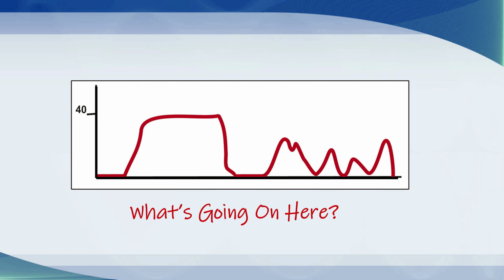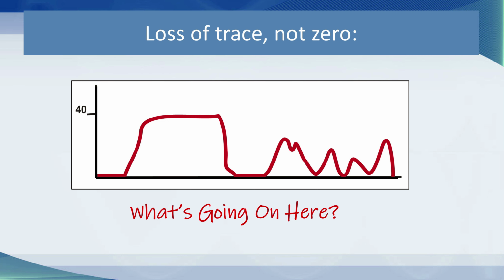So what's going on here? In this situation, you still have a CO2 trace. It hasn't gone to zero. There's a lot of squiggling going on. So carbon dioxide is definitely coming out of the patient. But it seems that not all of that carbon dioxide is being captured.